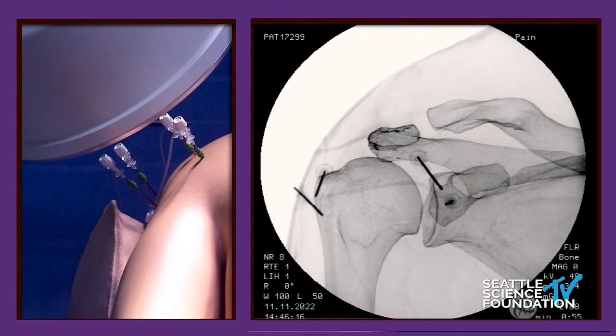And then just walk off laterally. Right now he's kind of poking the sphere or the ice cream scoop, and you really want to go lateral here — you'll feel that walk off. Go a little bit more cephalad. That's perfect. And so again, what we would do is check for motors, making sure that we're not seeing any axillary muscle or deltoid twitch. Then if we don't, a little local anesthetic, radiofrequency ablation for two and a half minutes. So that's it — that's taking care of the posterior aspect. You've denervated 95%.